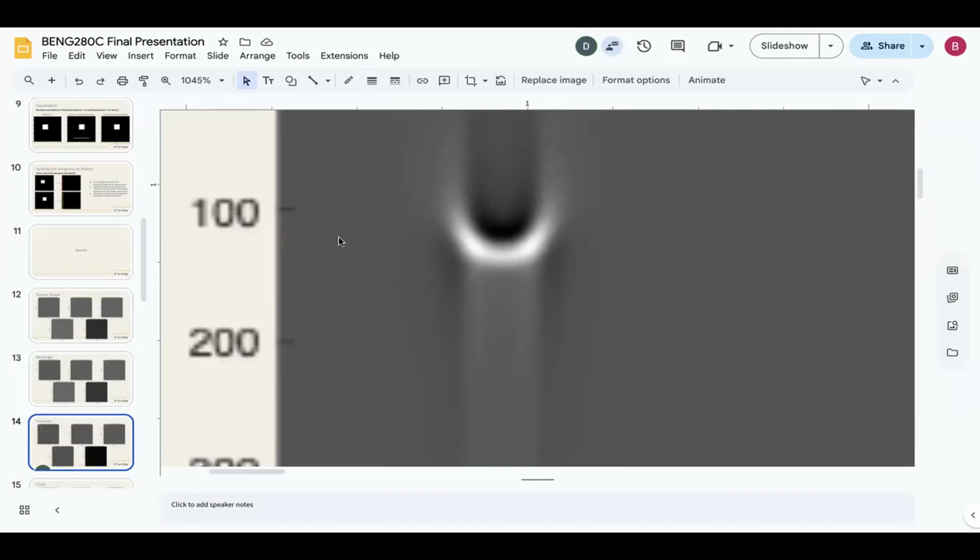Right around there. Okay. So you think it's not starting at the far left edge of that arc. It's starting somewhere down the arc, right? Yeah, if we were to pinpoint it, around 130. Okay. And it's interesting, right? The motion is horizontal, but the artifact is like this smiley face. So it's actually quite a lot different from other imaging modalities in how this works.